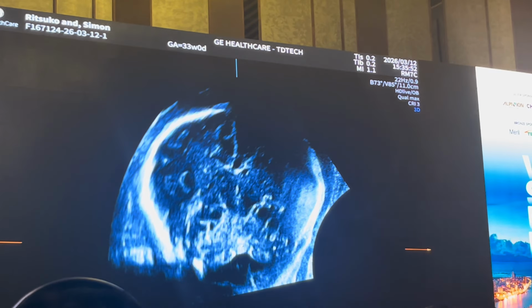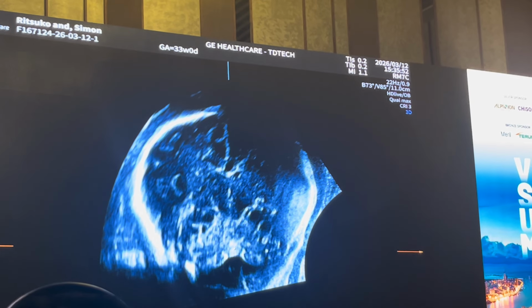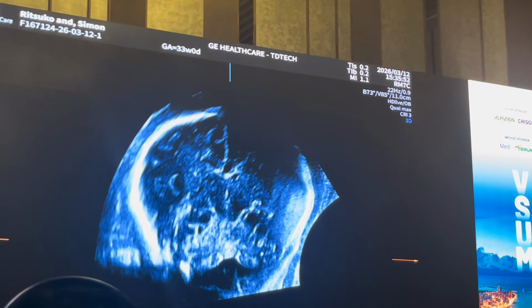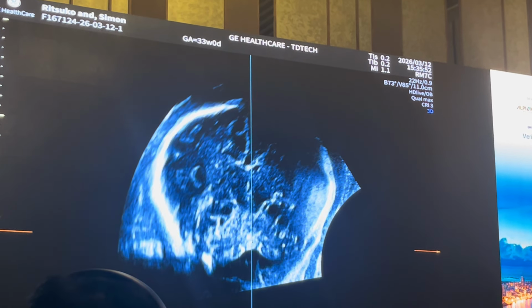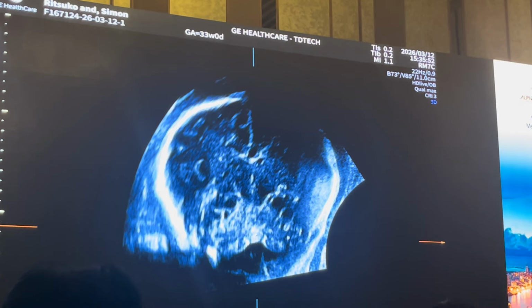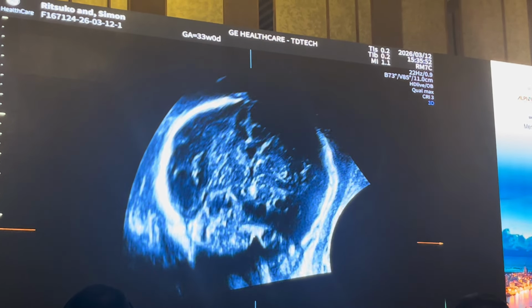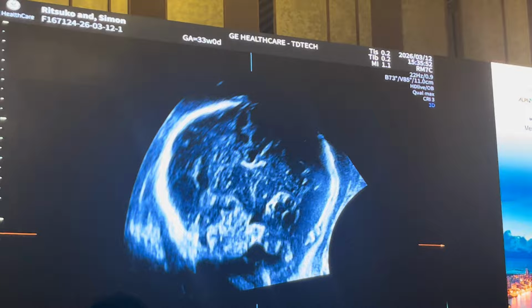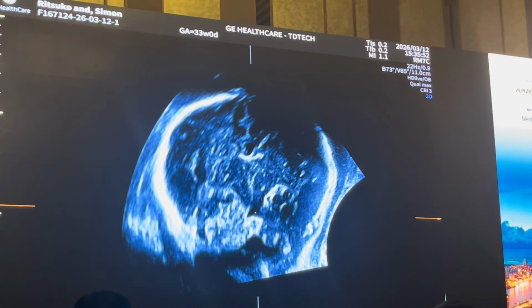So we then go to the A plane, and I generally manipulate the A plane. So after getting it in the A plane, I then rotate on the Y axis. And the reason that I do that is because I like to work on my orthogonal planes and translations through my volume to see the fourth ventricle. There's my fourth ventricle.